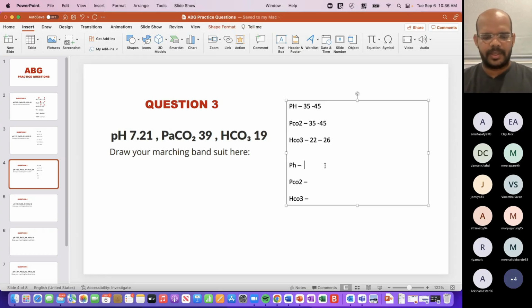Okay. Very good. PCO2 39. It's in the normal range. HCO3.